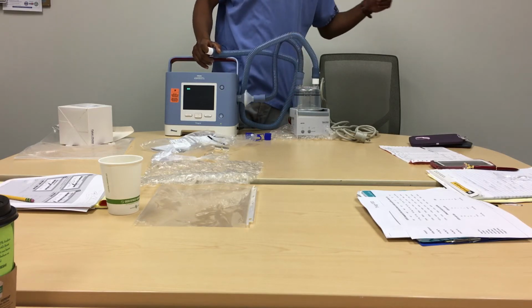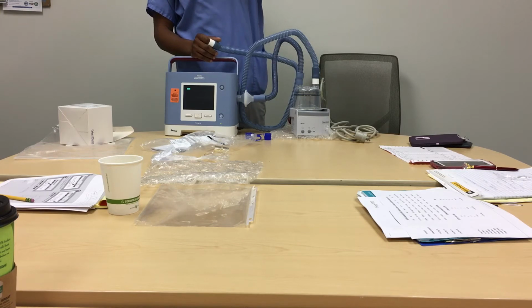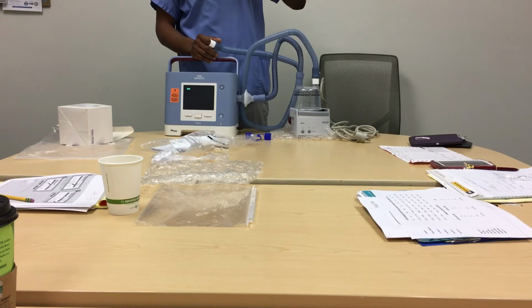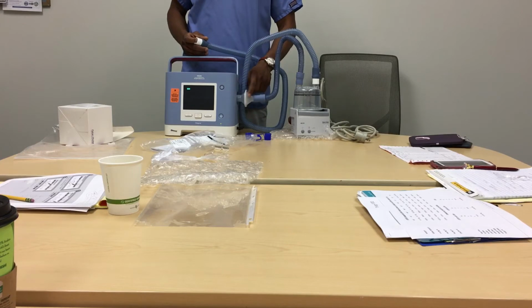But again, it's at home. There is that continuity of care, but it's not all there. Nobody always follows it to the letter. So if you tell them to change it every day, they might change it every 3 days, and we'll be lucky. I won't take that chance. It really depends on the home health nurse on that one.